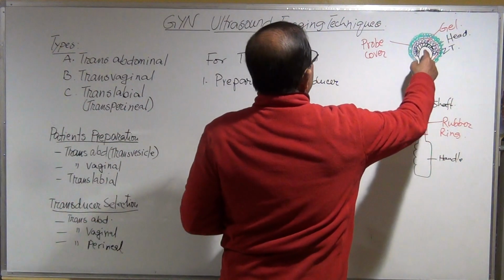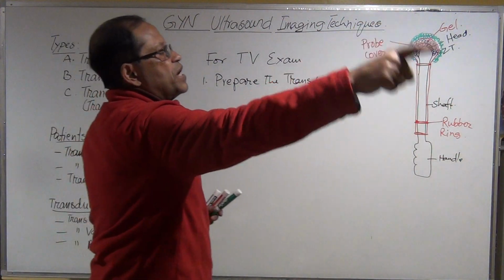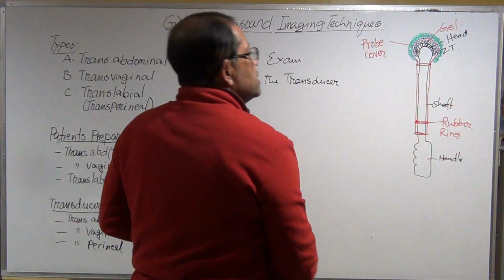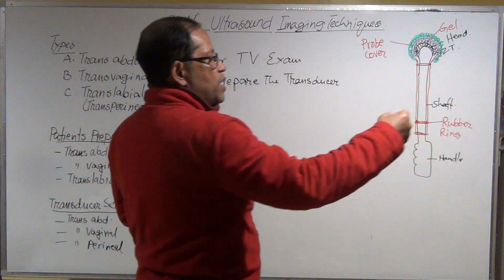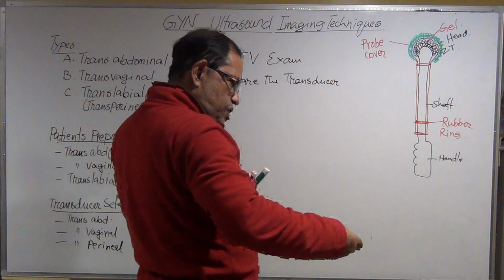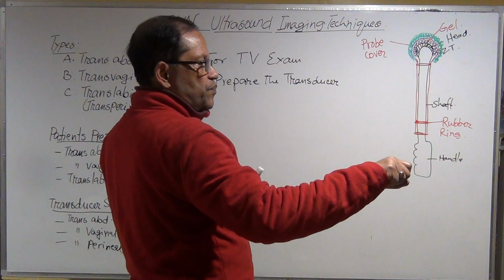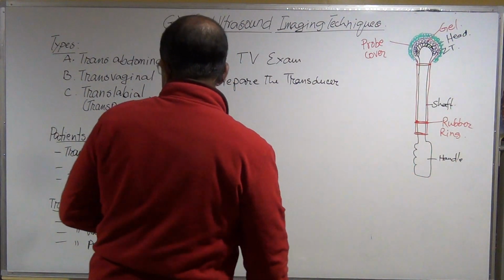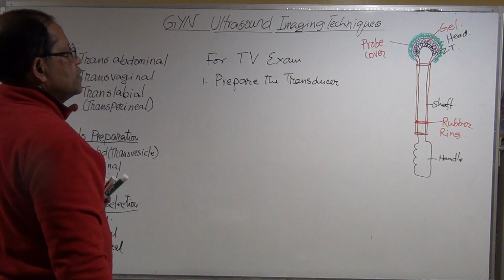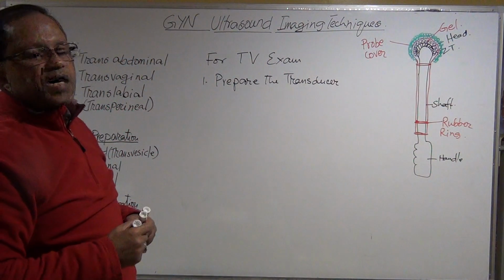Okay, so now when it is going inside, look at the monitor, you see the structures can be seen, and you take care, make sure you are oriented nicely, sagittal and transverse. Sagittal and transverse. Good. So prepare the transducer nicely.